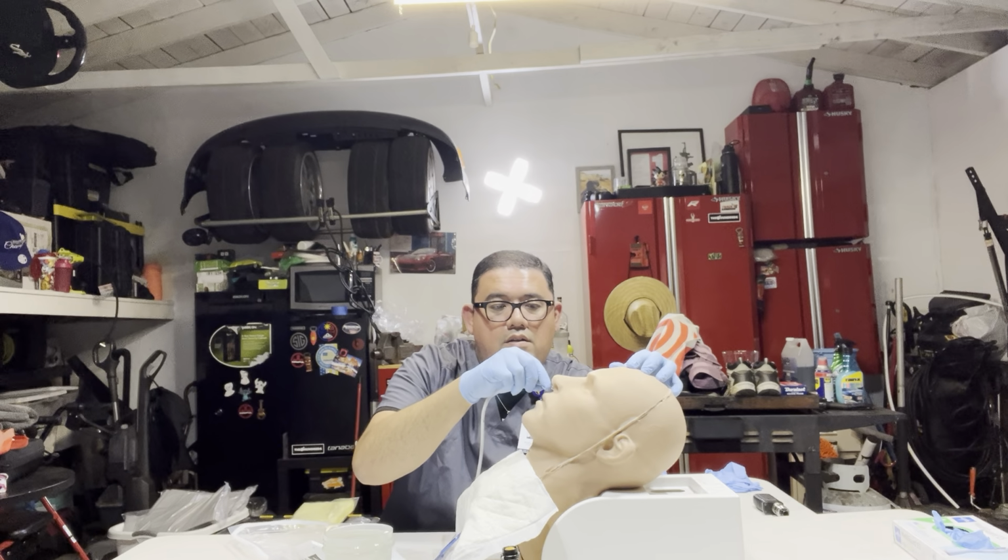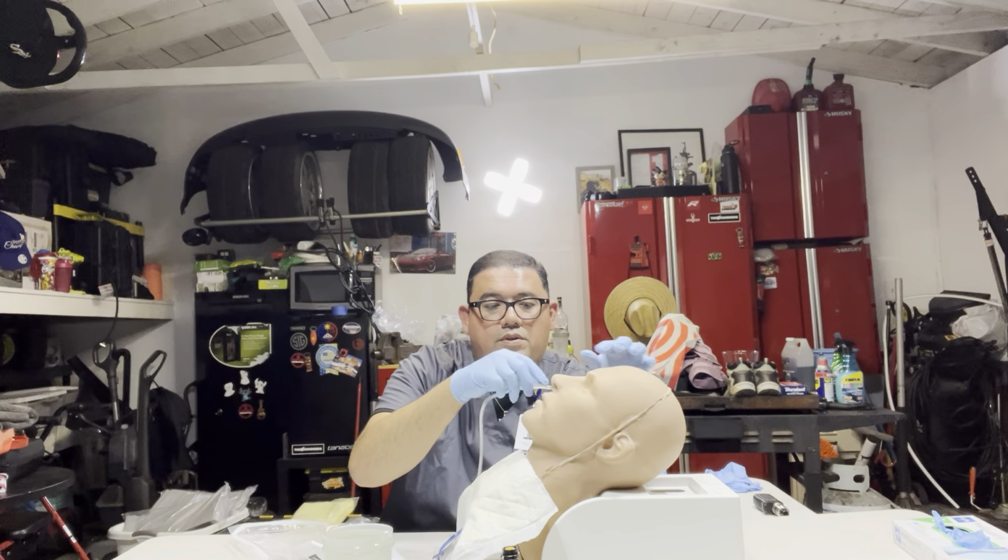Okay, now we're at the 60 mark. Perfect.